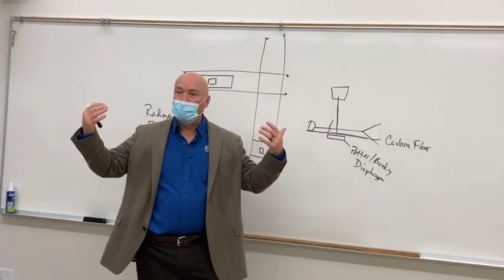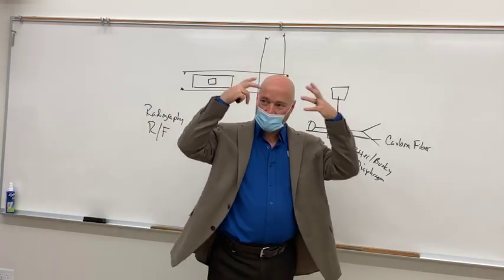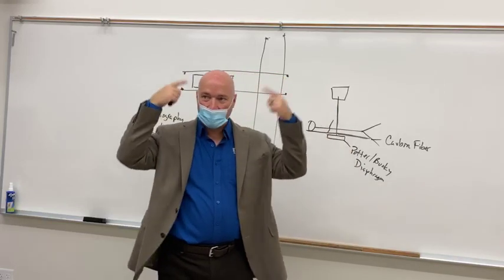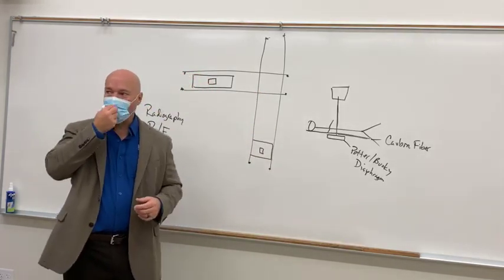They call it a halo. The patient has this vest-like thing on, and he's got these little pins that screw into his head, and then he's got rods, these little black rods that go from the vest all the way up to the head portion. That's what we call a halo.